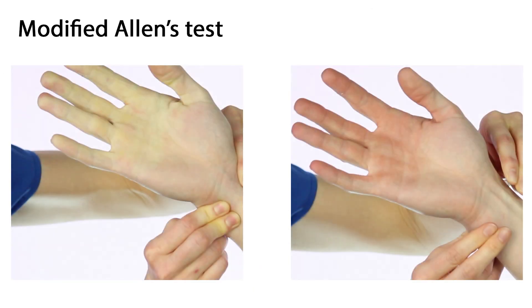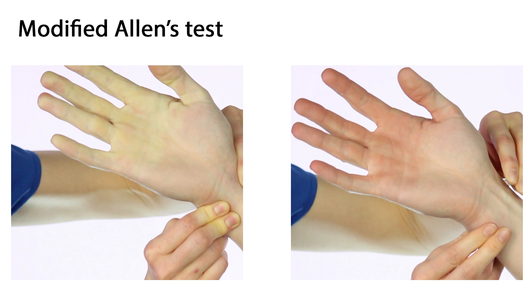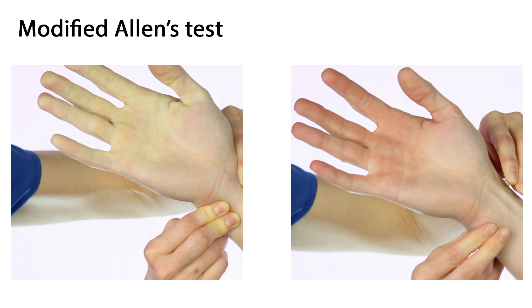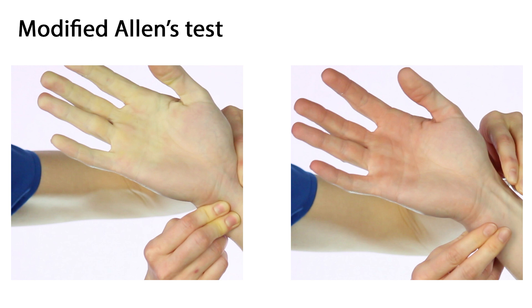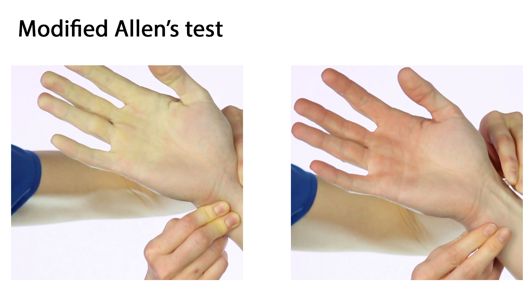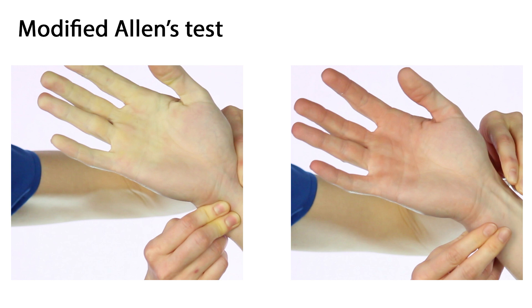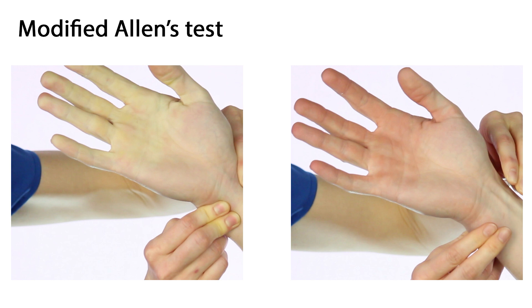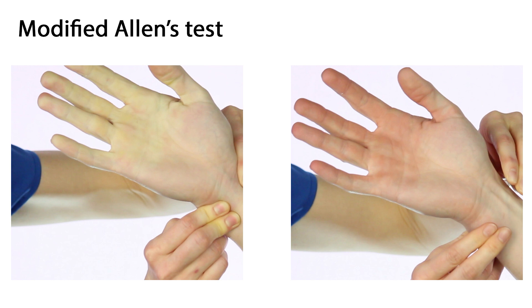Before inserting an arterial line in the radial artery, the modified Allen's test is done to determine collateral circulation of the radial and ulnar artery. Have the patient elevate their hand and clench their fist for about 30 seconds. Apply pressure to the radial and ulnar arteries in the wrist to stop blood flow to the hand. The elevated hand is then opened and should appear blanched. Release ulnar pressure while maintaining radial pressure to check if there is adequate blood flow back to the hand. If the hand quickly becomes warm and returns to its normal color, this is a positive Allen's test, meaning one artery alone will be enough to supply blood to the hand and fingers, and the radial artery can be used for the arterial line. If the hand remains pale and cold, it is a negative test and an arterial line should not be placed in this location.